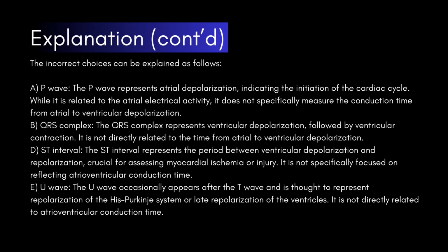That will do it all for the video today, guys. As we move along, we're going to get closer and closer to interpreting ECG graphs, so bear with me. If you understand all these basics right now, getting to the graphs at a later time will be a much better experience, and it will be a piece of cake compared to looking at them blind without understanding the basic science principles behind them.